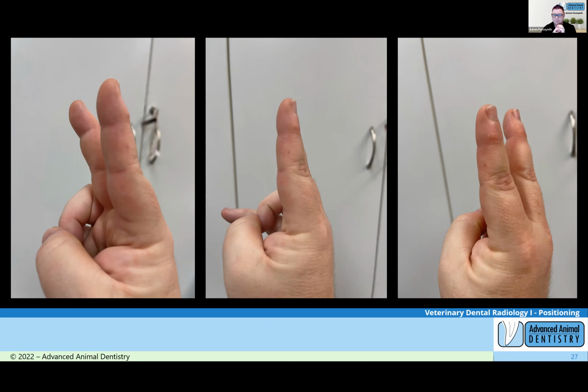Okay, yeah, sure. Another way to visualize it is you can do it right now while sitting in front of the computer. Put your hand up right in front of your face and look at your 2 fingers. What you're looking at is your index finger, and your middle finger is occluded by that. We know there's a second finger there. It's a little bit like this, and this is where we often use the SLOB rule, when we're looking at the mesial roots of upper premolar 4. When I come around here and look, that middle finger has moved in the same direction as my head. It's come around. So it's moved the same. And the opposite is the front finger, my index finger, which has moved in the opposite direction. It's moved relatively forward. And that's the SLOB rule.